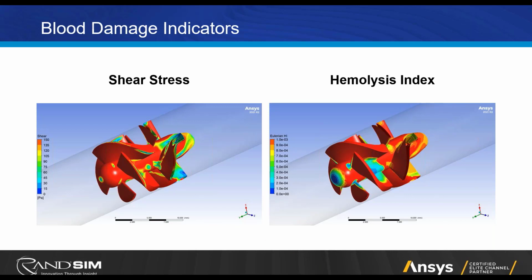And once the platelets are activated, if they find a place that they can sit where there's stagnation, then that's when clots form. So for a clot, you have to have two things: relatively high shear stress above the threshold of about 10 pascals, and also some relatively low regions of wall shear stress, which indicate stagnation or reverse flow. So those are the things we want to try to avoid. Okay, that's just the background for what's coming in the next slides. But again, the hemolysis plot on the right, I just played with the maximum value to get it to look qualitatively similar to the image on the left. Next slide.